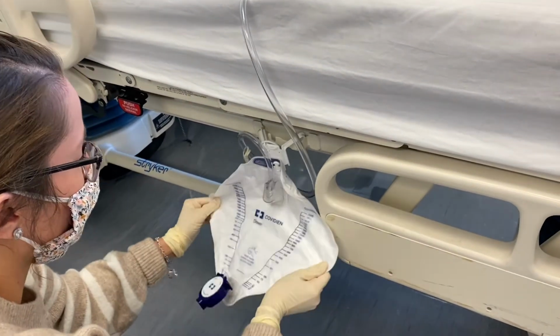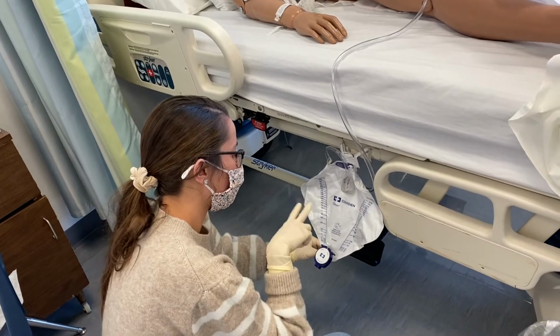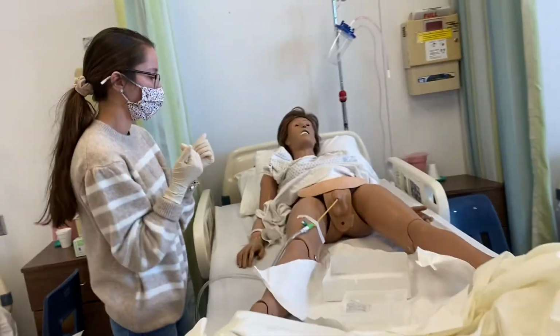Once I have inserted the catheter, I would document the size of the catheter. I would look in the bag and look at the urine color, the clarity, the volume that was in it. And I would document all that. I would also document any peri-care that I had performed today.